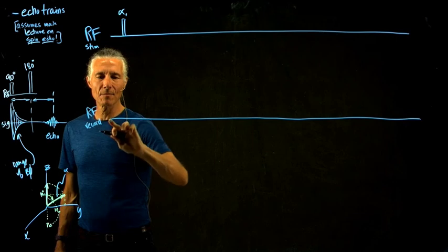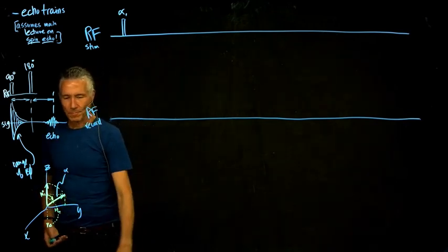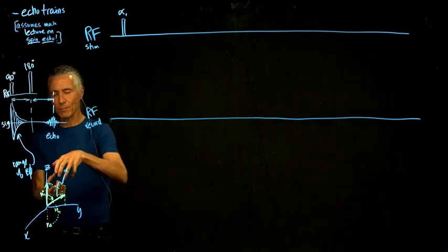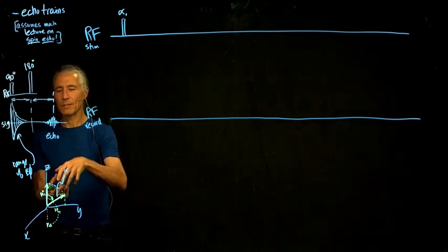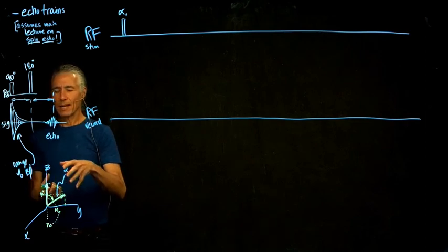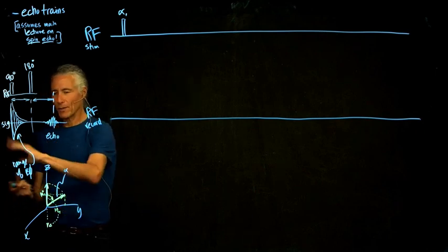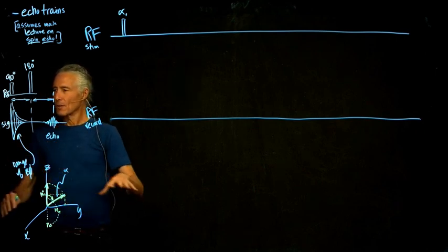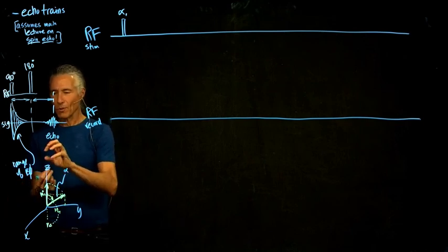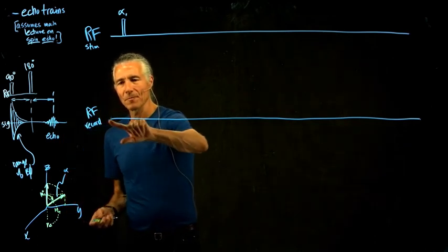And like I said, if we had a transmit-receive coil, we could transmit with the RF coil and then receive with the same coil. Most times when we're doing brain scanning or even body scanning now, we transmit with a very big coil that transmits to the whole sample, which is you, and then you just have very local coils that pick up. But it could be the same coil also.